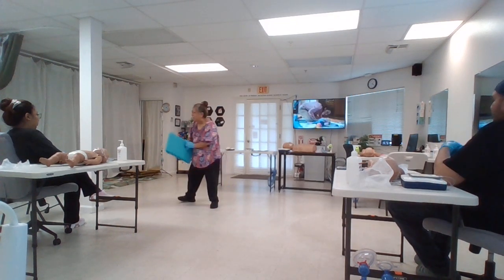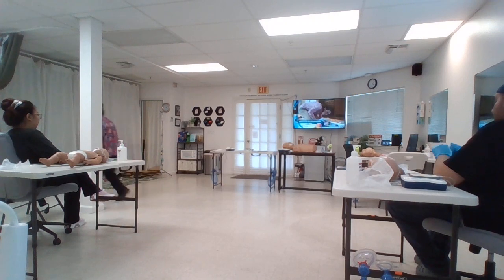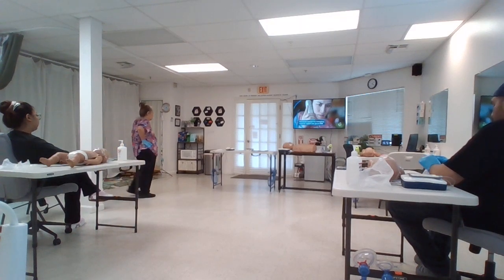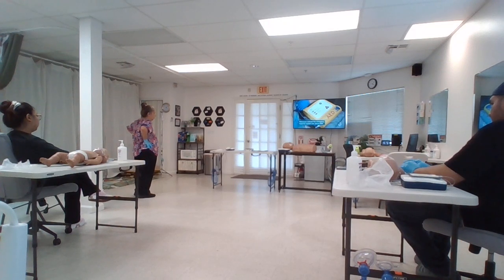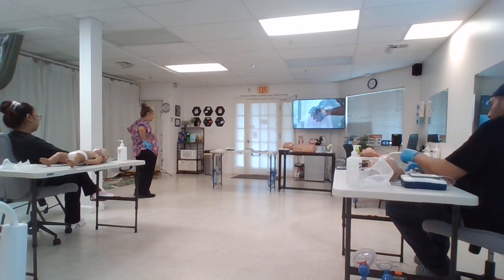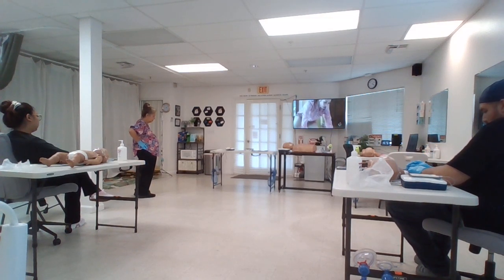First, if the cardiac arrest is witnessed, check the infant for a response and breathing. If the infant is unresponsive and isn't breathing or is only gasping, send someone to activate the emergency response system and get an AED. If you're alone and don't have a mobile phone, take the infant with you to phone emergency services. Or, if necessary, leave the infant and find a phone.